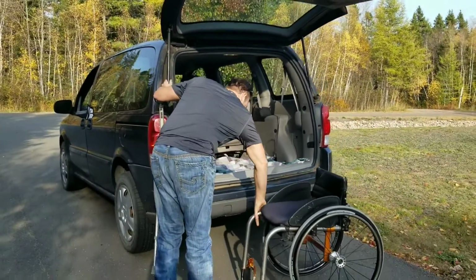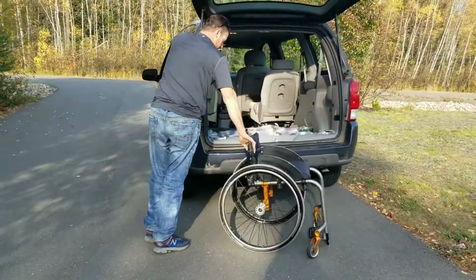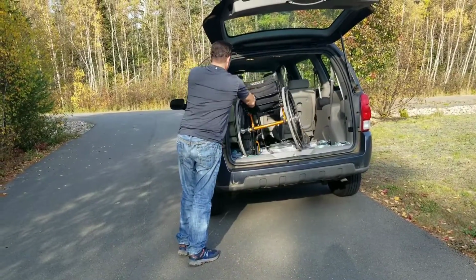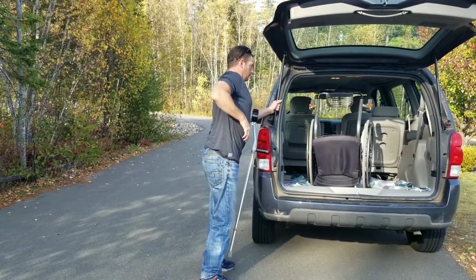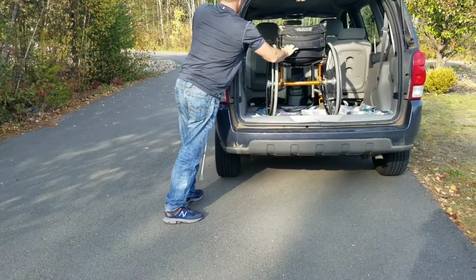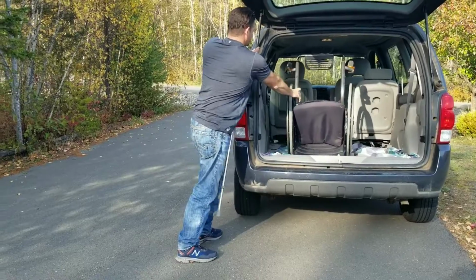Like that, take the brake off, somehow, there we go. Grab it. These chairs are really light. This chair here weighs... I always tip it backwards, so when I'm driving, it wouldn't rock back and forth. Like if I do it like this here, it'll go all over the place. So I just tip it backwards, and it's fine.